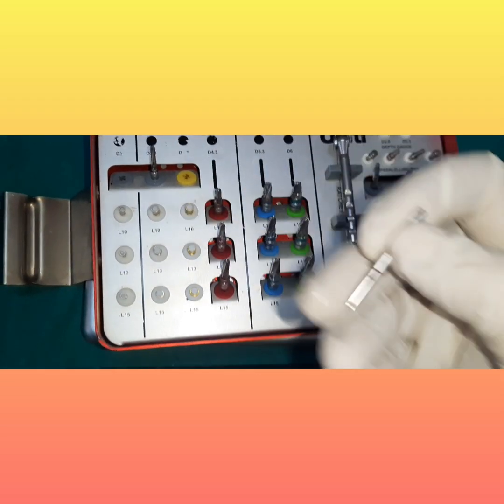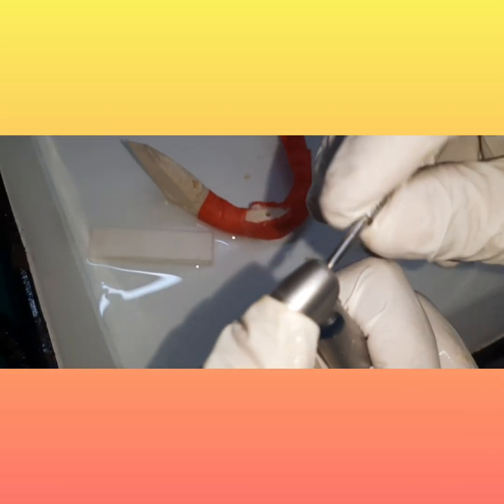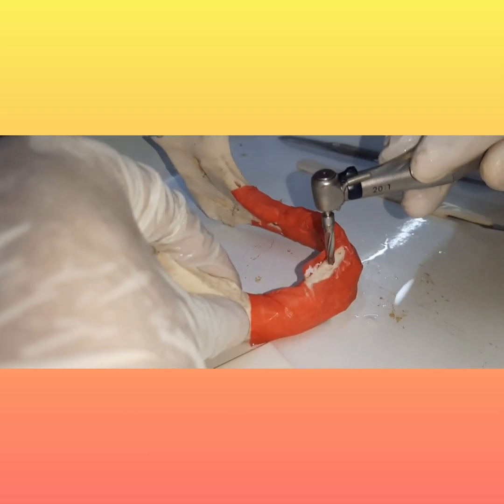Next we'll take the other drill, that is 3.7. Place it, lock it into place like this, and then we are going to go in till 10 millimeters.